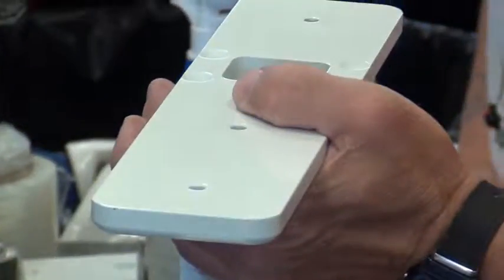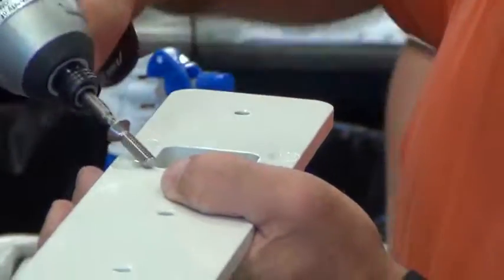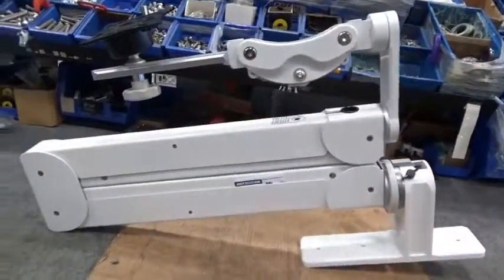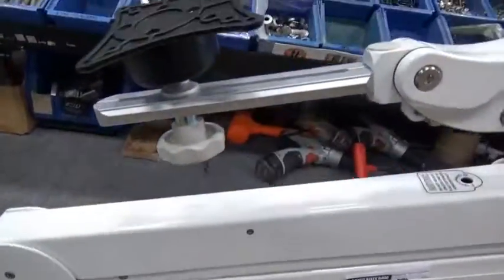Attach wall plate with 1/4-20 by 1 inch flathead socket cap stainless steel screws. The finished Elite arm is complete and ready for shipment to the customer.